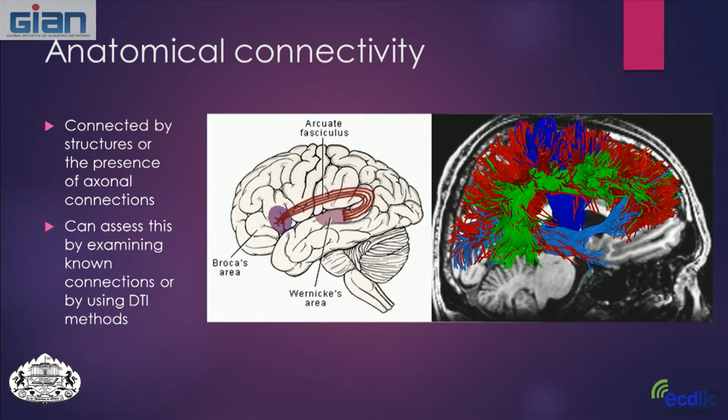So like I mentioned, tomorrow we're going to talk briefly about diffusion tensor imaging, and diffusion tensor imaging looks like the one here on the right. This is a structural imaging technique that employs magnetic resonance imaging and uses the fact that the diffusion of water takes place along the axonal tracks and in the main direction and doesn't really diffuse outside of the track. So we can take this property and use MRI to create these white matter tract images. And you can see here you get a very beautiful image which details the connections between regions of the brain. So that's diffusion tensor imaging and white matter tracting, and that's sometimes referred to as tractography.